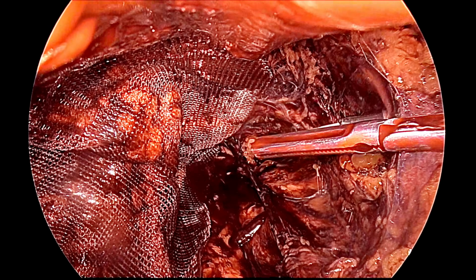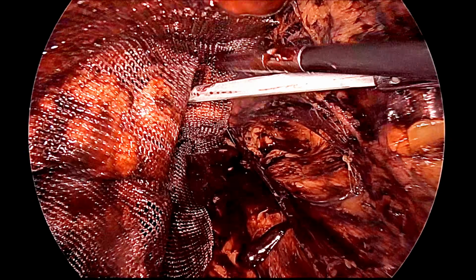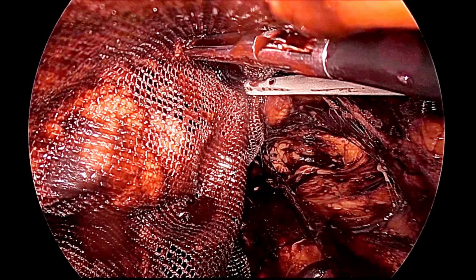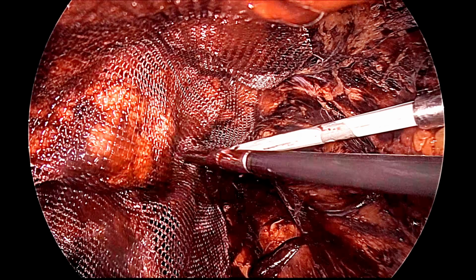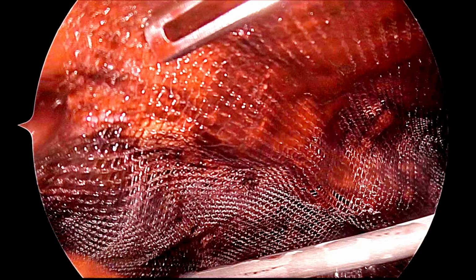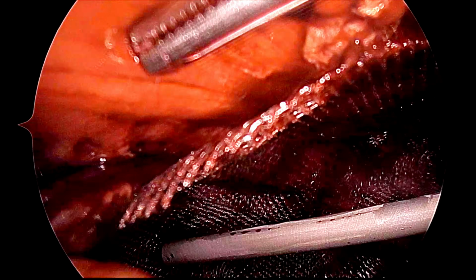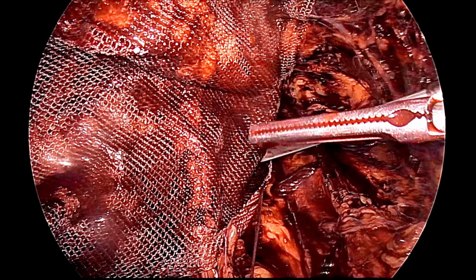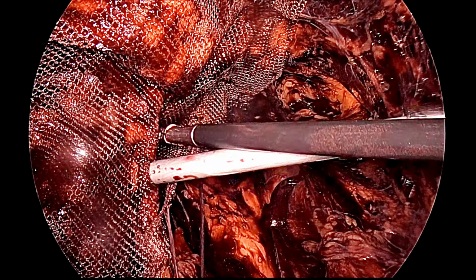Now, we will just use a few tackers. Tackers may not be necessary. The first tacker here we are firing on the Cooper ligament, it may not be necessary, but if you fire a couple of tackers, this is one on the rectus abdominis muscle and one over the lateral extreme, supralateral on the arc of the transversus abdominis. Just 3 tackers are applied, so that the mesh should not migrate, and now slowly the instruments will be taken out and the gas will be released.